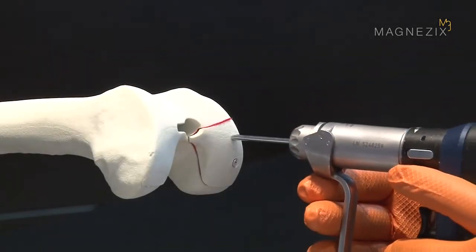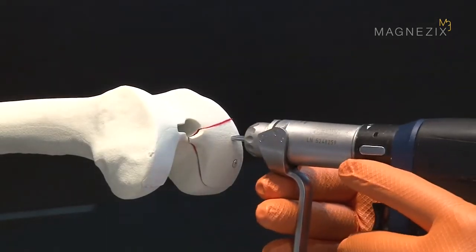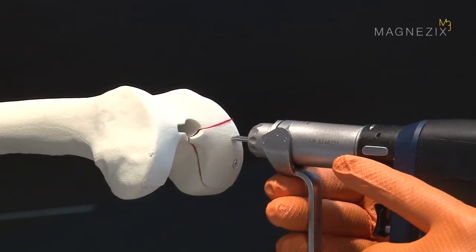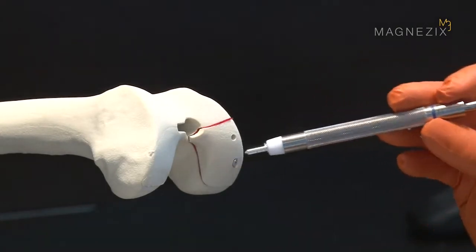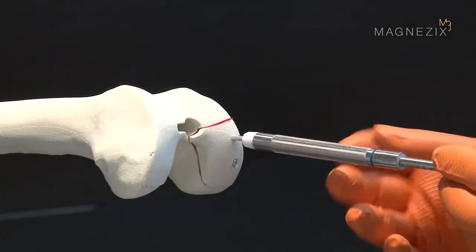Before the second pin is inserted, the reduction wire must be carefully removed with minimum axial pull. The second pin is now inserted in the same way as the first.